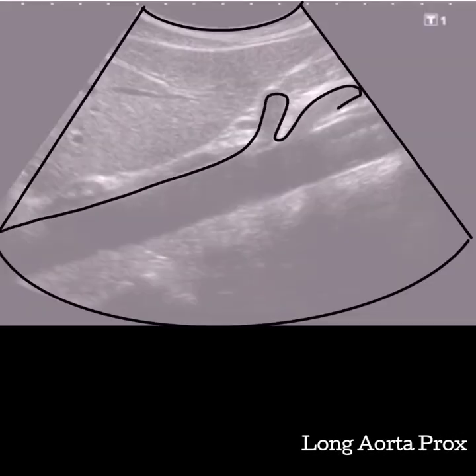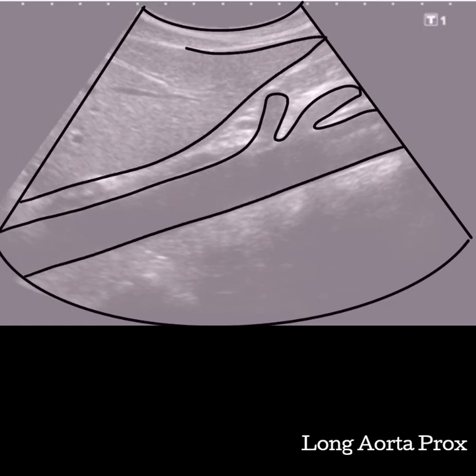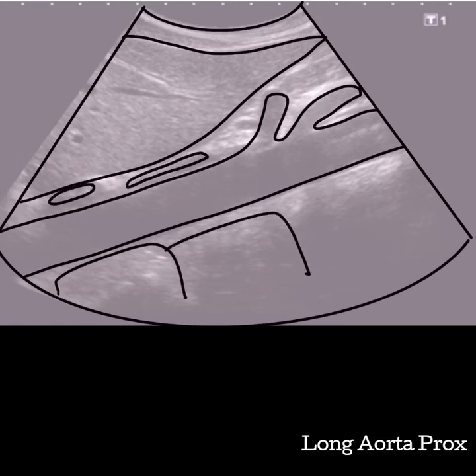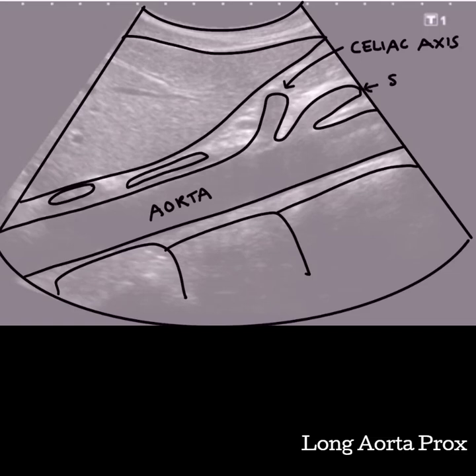Center the transducer on the body at the xiphoid process. Elongate the aorta so it extends all the way across the screen using small twisting motions. When one side looks good, pivot from that side so that the transducer connects it all the way through. Try having your patient take a deep breath in to make the aorta more horizontal and bring the proximal portion into view. You should see the heart and diaphragm superiorly. To show that you are proximal, demonstrate the location of the celiac axis and superior mesenteric artery takeoffs on the anterior side of the aorta. The left diaphragmatic crux, esophageal junction, and the liver sit anterior to the aorta as well, where the spine will be seen posteriorly.